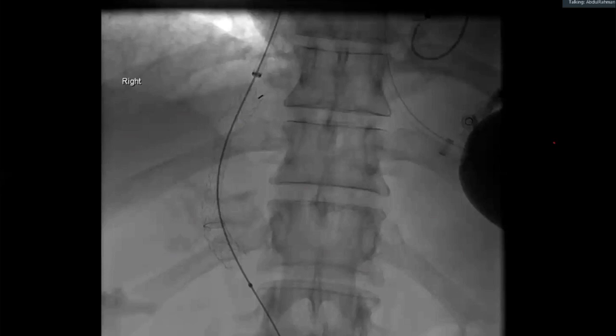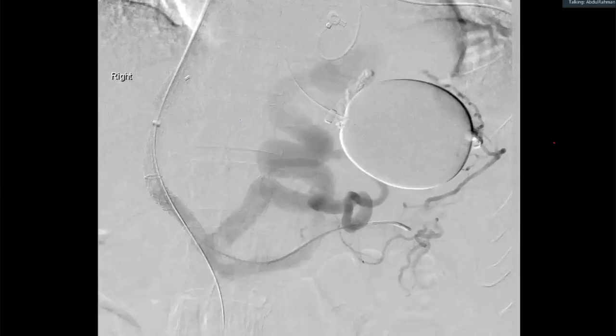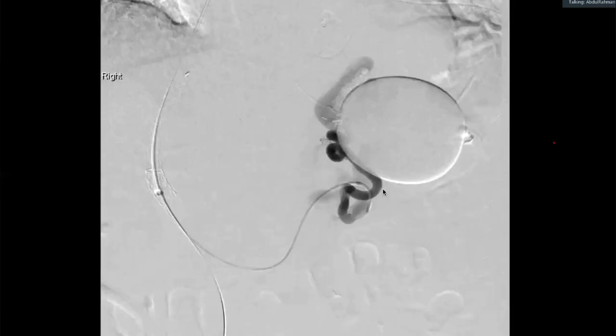So a TIPS stent was put in. I'm not going to go into why a TIPS stent is inserted, because remember, I'm talking about embolic agents. You can still see, despite a TIPS stent, these varices. As I go through this image, a selective venogram of this varix shows active contrast extravasation. So this varix is still bleeding. So this is a gastric balloon. You may be shown a plain film of this, so remember that. And here's the glue that has been endoscopically injected in an unsuccessful attempt to stop the bleeding.